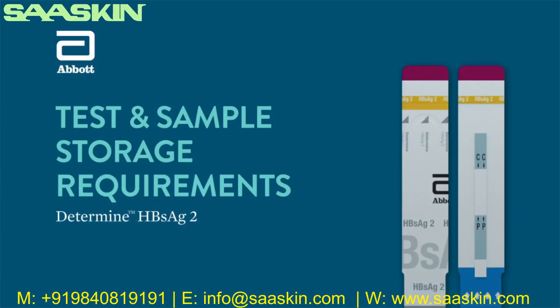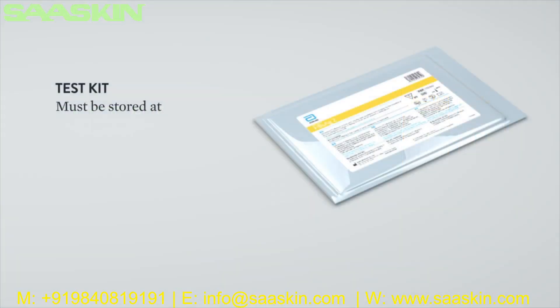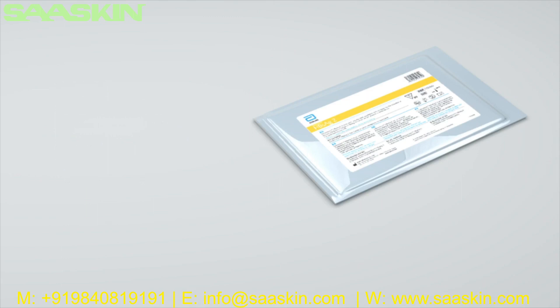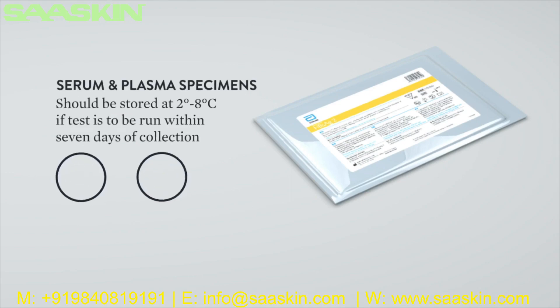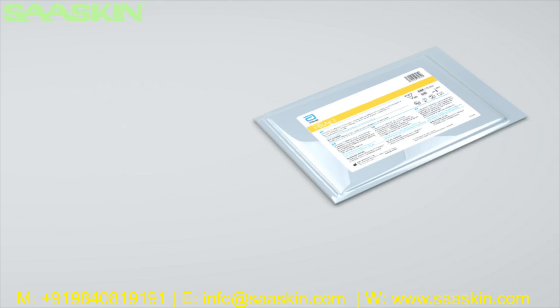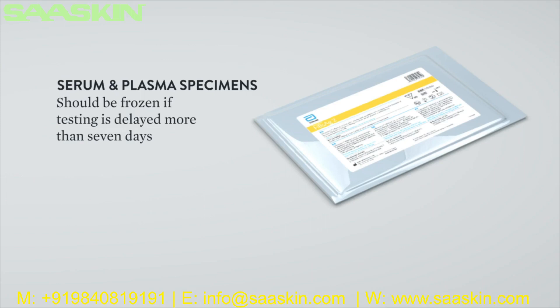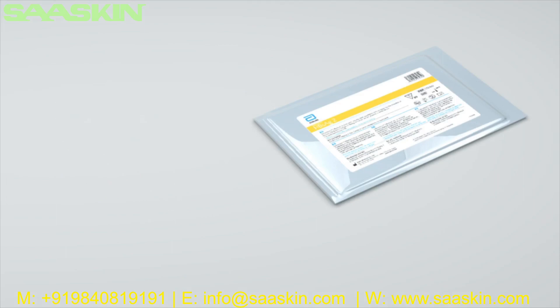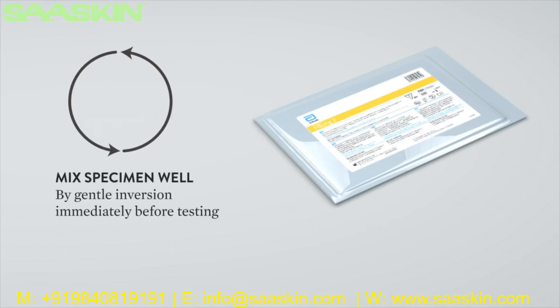Test and sample storage requirements: The test cards in the aluminum Ziploc pouch containing desiccant must be stored at 2 to 30 degrees Celsius (36 to 86 degrees Fahrenheit) until expiration date. Serum and plasma specimens should be stored at 2 to 8 degrees Celsius if the test is to be run within 7 days of collection. If testing is delayed more than 7 days, the specimen should be frozen at negative 20 degrees Celsius or colder. Mix specimen well by gentle inversion of the tube immediately before testing.